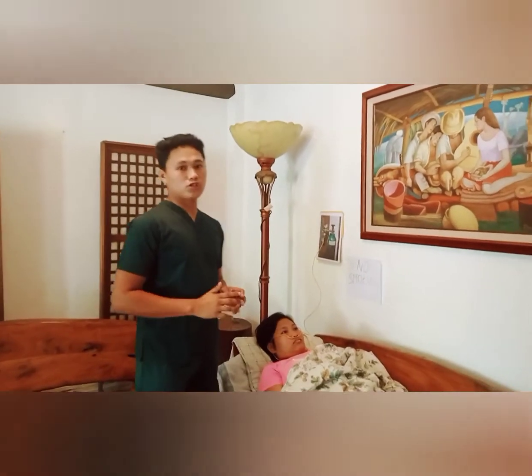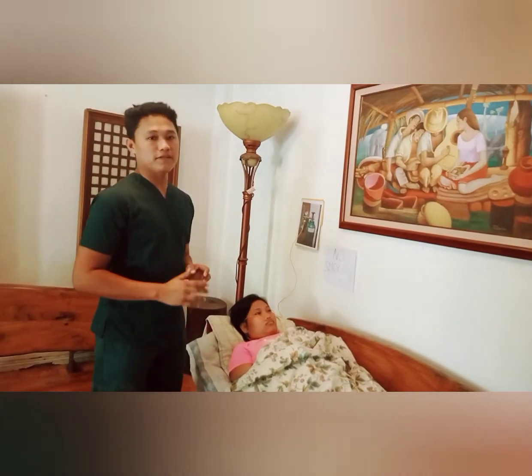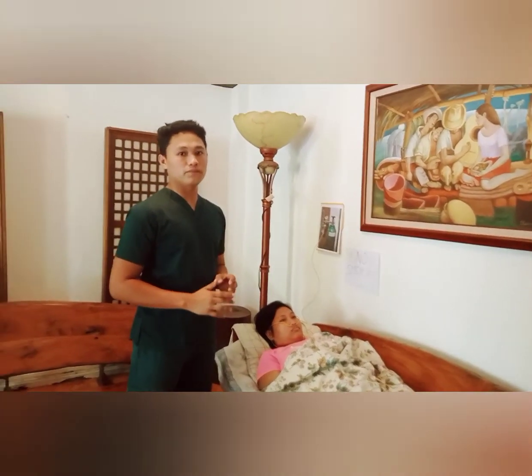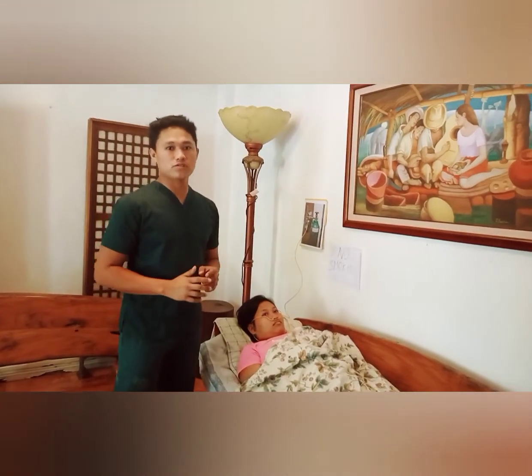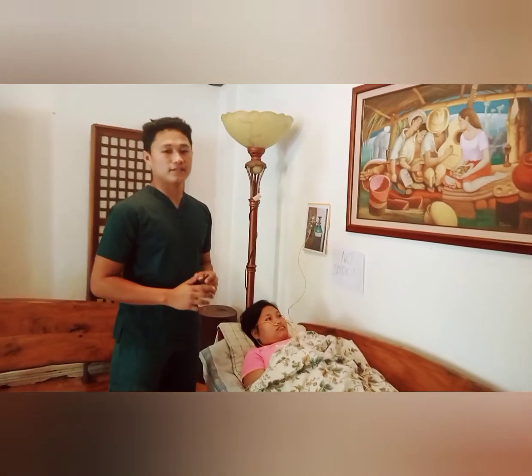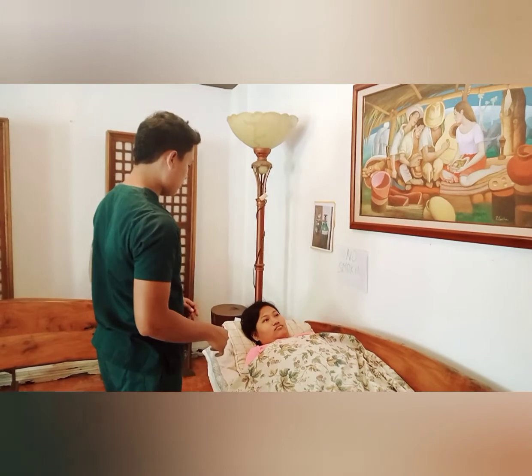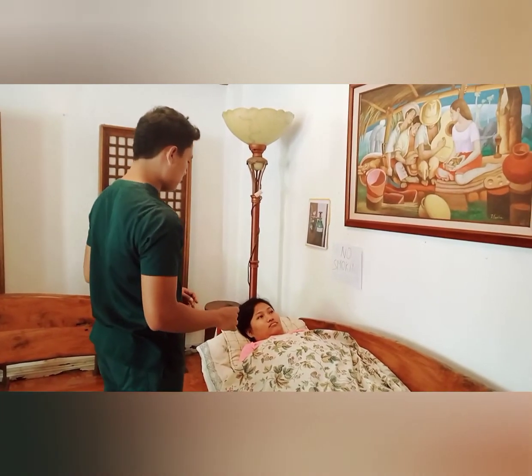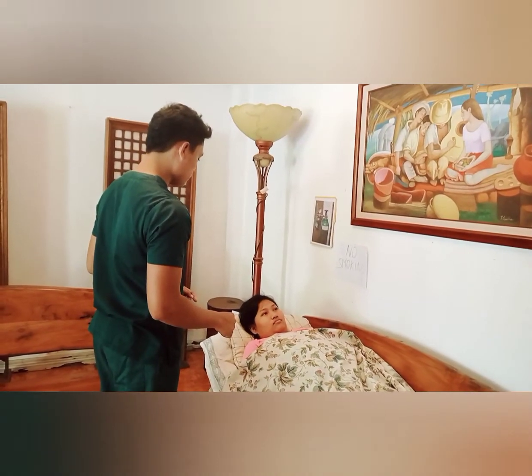So perform hand hygiene and wear gloves if available to prevent spread of infection and microorganisms. And next, explain the procedure and its purpose to the client. The client has a right to know what is happening, and this allays his or her anxiety. Good day, ma'am. My name is Janet Morales, and today I will perform the simple mask method. Is that okay with you? Yes. Okay, thank you, ma'am.